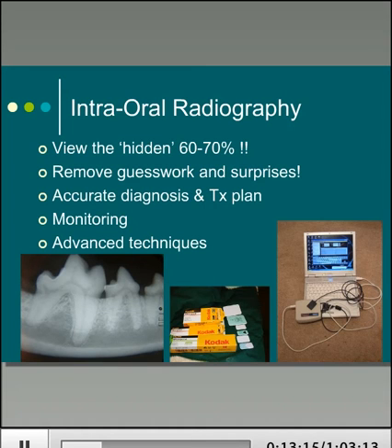And if you don't have it, then you have to do your best, but you can't do the same job. Unfortunately, you've just got to try your best. Important also for monitoring, and once we get to advanced techniques, it's absolutely imperative that you can do really good dental x-rays.